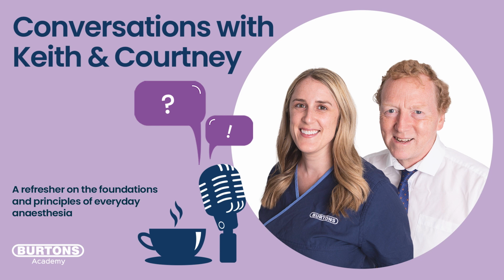That's always fun. Or you've got a machine that wants you to set a respiratory rate, in which case that's fine. And you're going to set a respiratory rate based on what would be the normal respiratory rate for that animal. And again, not to get too excited or too worried about it, but if it's a cat, let's go for somewhere between 15 and 20, probably erring towards the 20. If it's a medium-sized dog, you're going to be down at the 14, 15. Big dog, you're going to be down 10, 11, 12. I say not to worry too much about it.